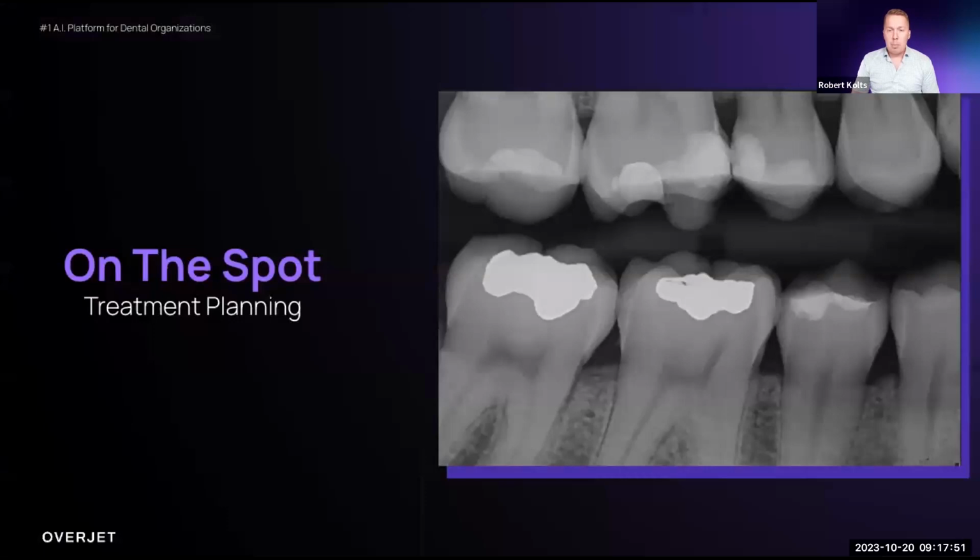And so just for a moment, I want you to do a little exercise with me. I want you to take a look at this radiograph, and I want you just to think in your mind, what do you see here? Okay, does this patient have any carious lesions? Does this patient have any calculus? Does this patient have any restorations that have recurrent caries or are failing?